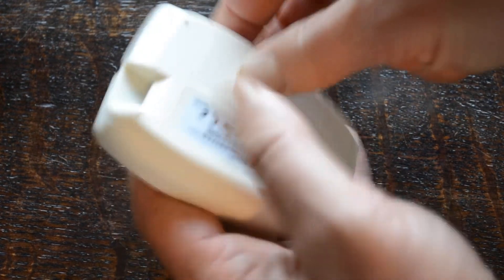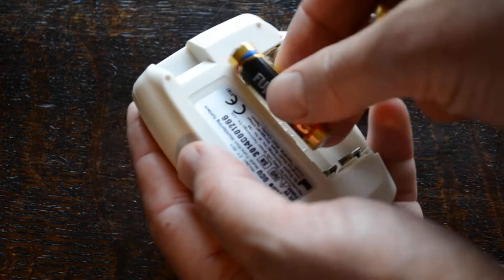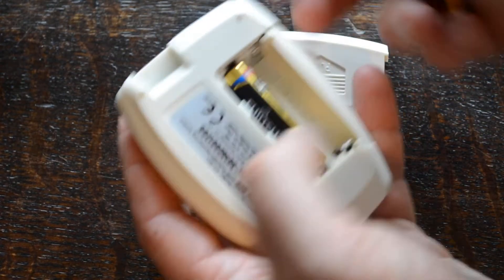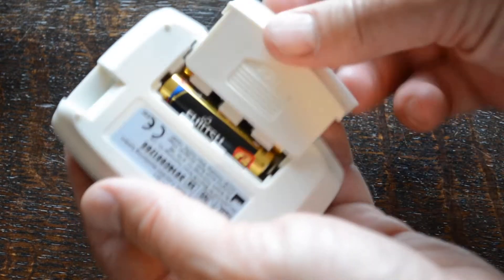The battery compartment is on the reverse and you apply two AAA batteries, which are supplied with the meter when you buy the kit. They go in and you'll hear the meter beep.